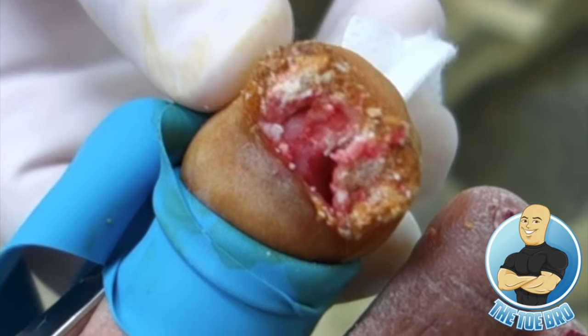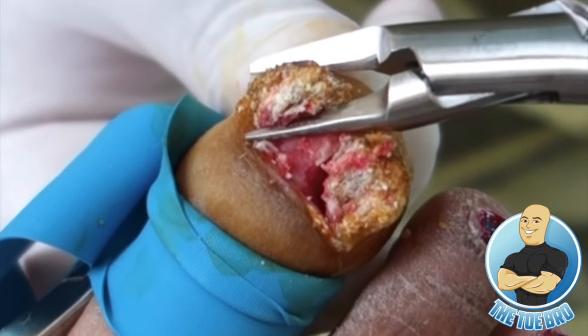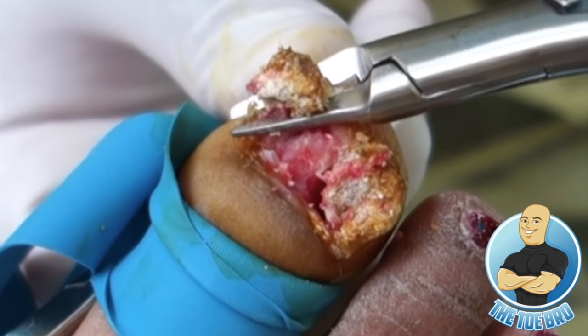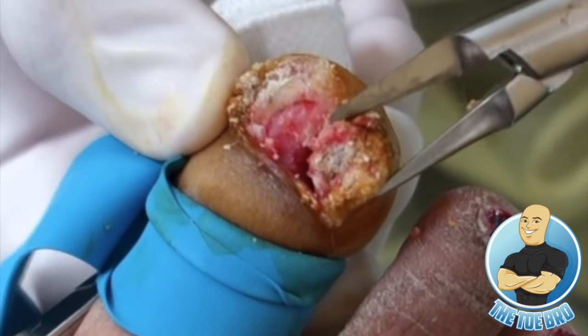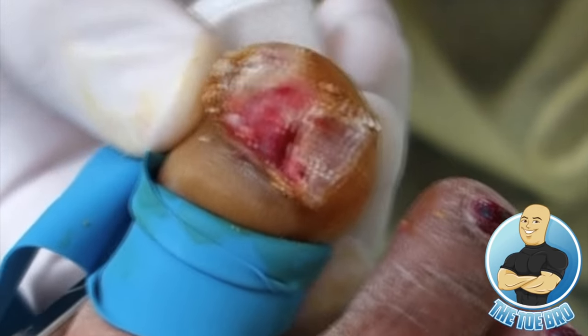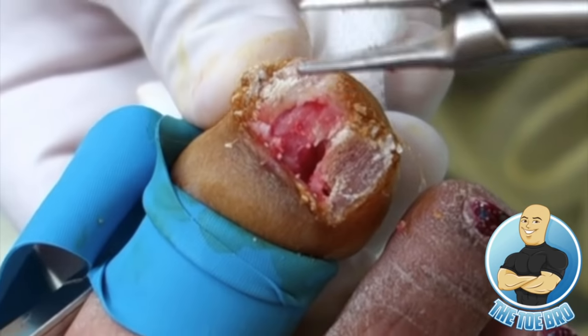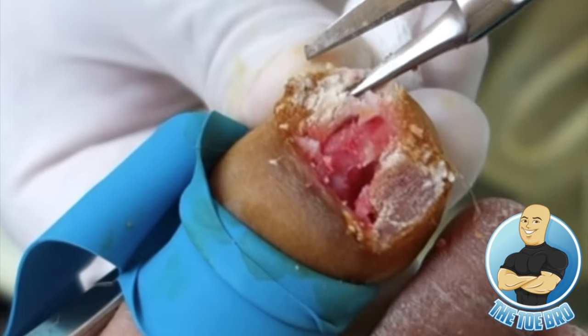So that was a fail. I quickly saw that it was way too hard for me to pull out any of the tissue with the hemostat. So after a quick decision, I realized the best thing to do is to trim down as much of this extra dead tissue, it's mostly warty tissue, and then go to the scalpel to kind of scoop everything out and clean it out properly.